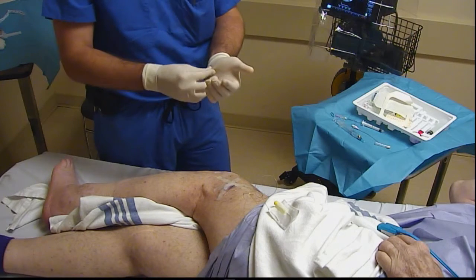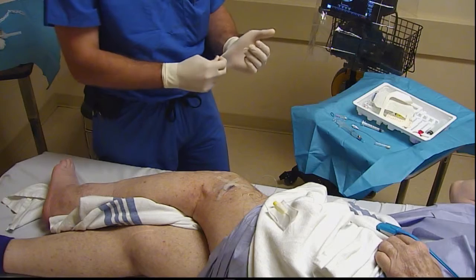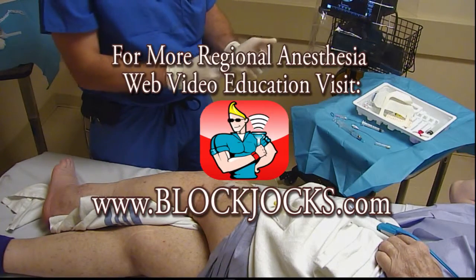And we are all done. That concludes today's block of the day — a left-sided popliteal sciatic block for a revision arthrodesis of the left ankle.